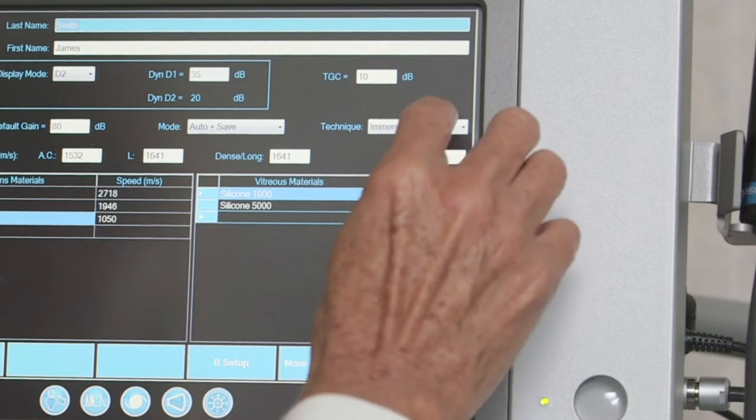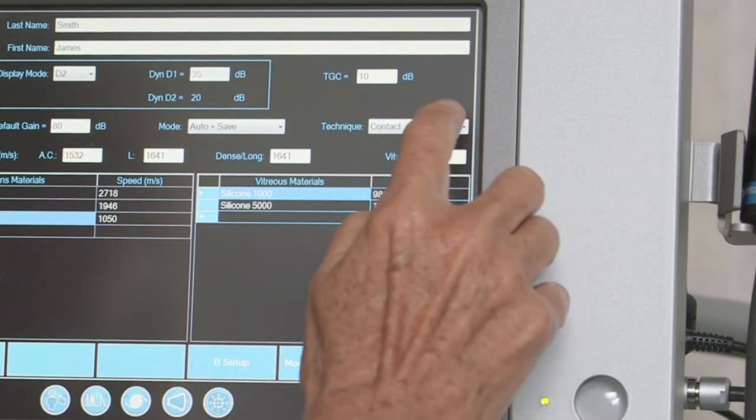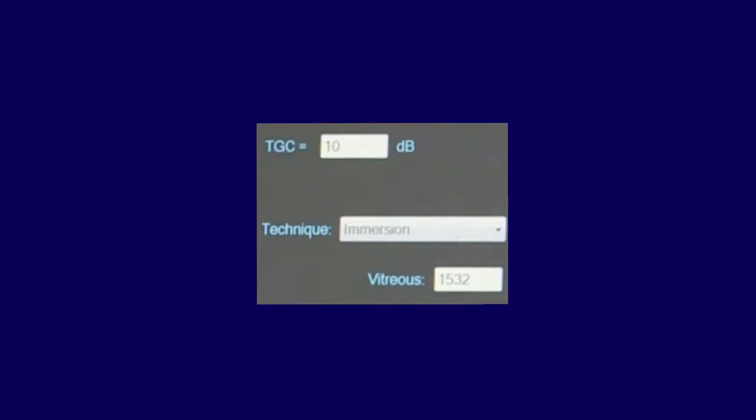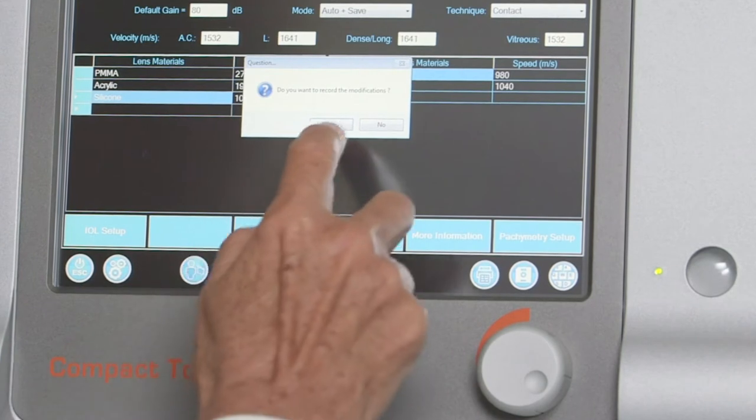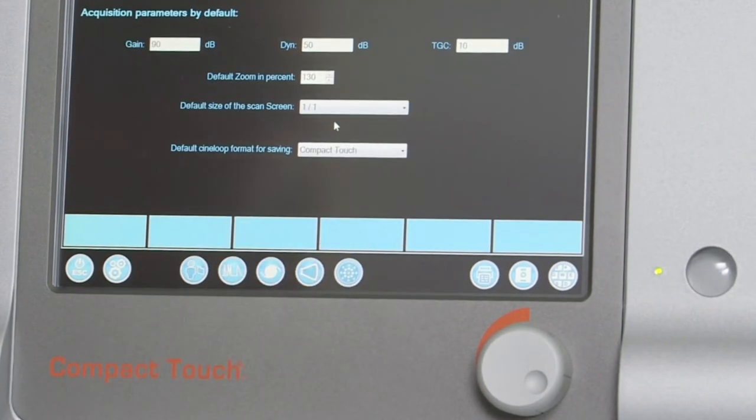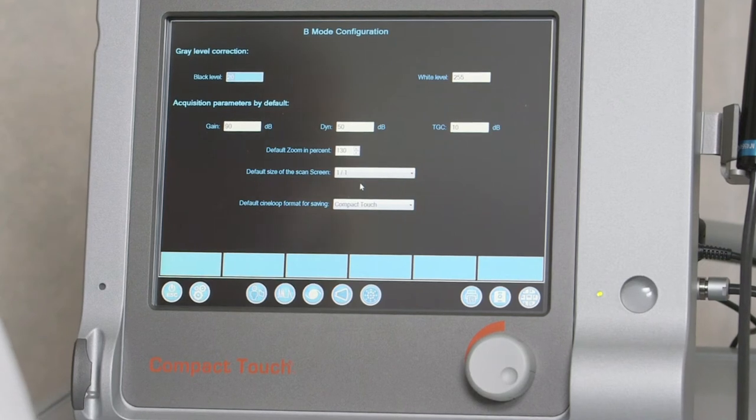Next, in the Technique field, choose Contact to use the A-scan probe for applanation scans, and Immersion to use the probe with a scleral shell and coupling medium. To enter or modify parameters for the use of a B-scan probe, select B-setup from the blue toolbar. Parameters include Gray Level Correction, Gain, Default Zoom, Default Size of the Scan screen, and Default Format for saving CineLoop sequences.